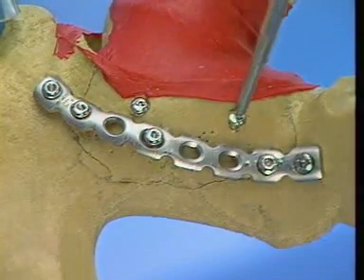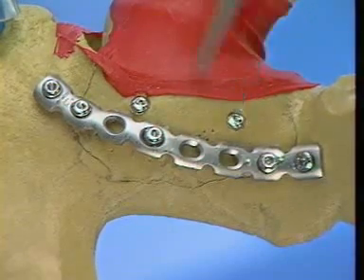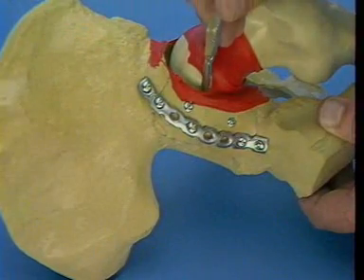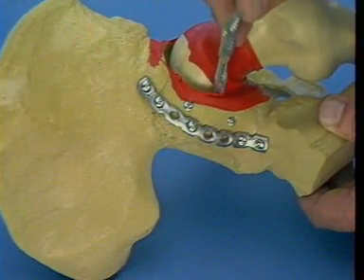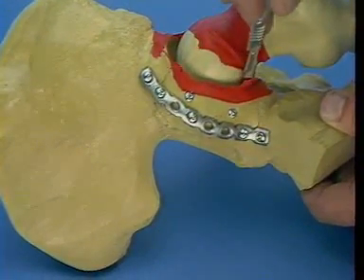The final reduction is typically not visualized because the hip capsule is left attached to the posterior fragments to preserve vascularity and hip stability. In our fracture model, however, we will now open the hip capsule to visualize the final reduction.